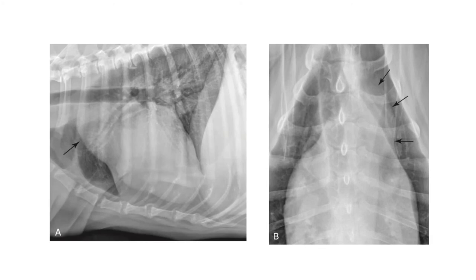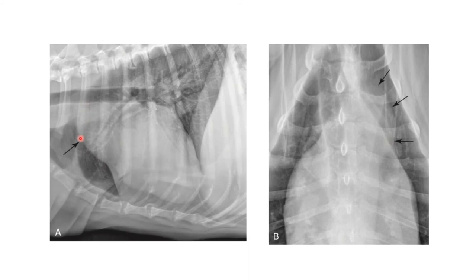Looking at two radiographs of a dog with aortic stenosis — a right lateral and DV view — in the lateral radiograph there's a bulge cranially and dorsally representing an enlarged aorta. On the DV radiograph, there's a bulge between 12 and 1 o'clock representing an enlarged aorta. This combination of a bulge on the cranial dorsal aspect and between 12 and 1 o'clock is typical of a patient with aortic stenosis.